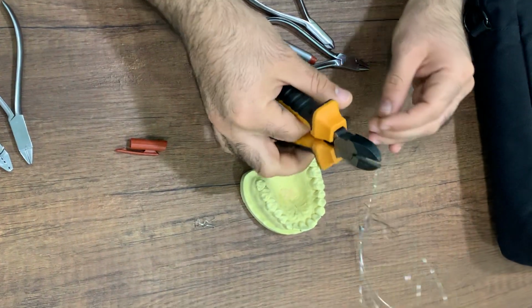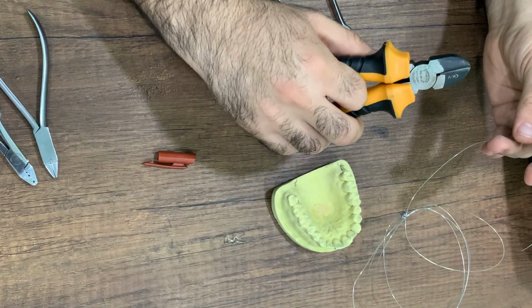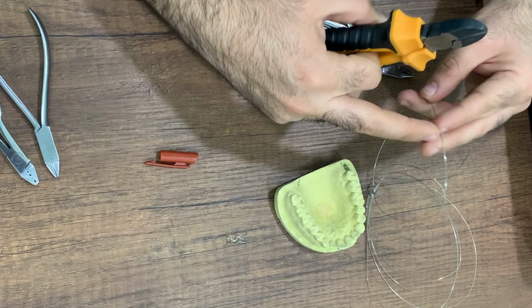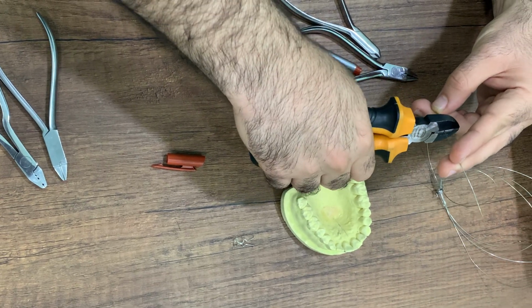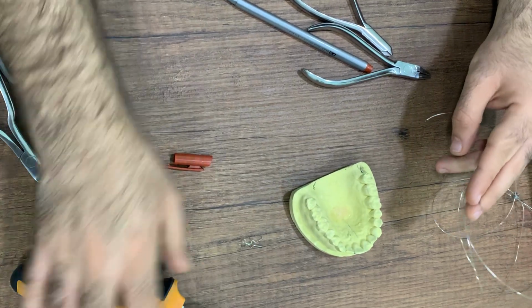Now we want to cut the wire. How do you cut the wire safely? To cut the wire safely, hold the wire on both ends between your fingers and cut to avoid having any wires fly away.